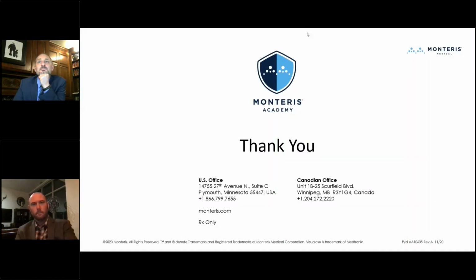So the last question is, can you speak to the preference for pulsed versus continuous heating? Do you see more precise targeting with pulsed waveforms? I can talk a little bit about that. I do think there are some advantages. Some of this is a question for engineers and why it works this way, but in my personal experience, the more gradual heating that you see with the pulsed laser is useful. The lesion grows a little bit more predictably, and that allows you a little bit better control, particularly if you're using it with something like a directional sidearm. You can see it start to progress in one direction and then rotate to apply heating to another part of the tumor lesion, etc. So I think that is valuable.